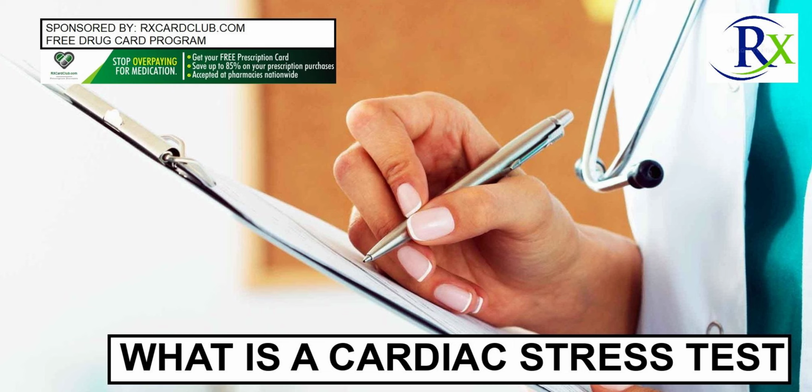The test is useful in diagnosing coronary artery disease, CAD, a condition often missed when a person is at rest. It can also be used to monitor the health of people with other forms of heart disease. This article explains the types and purpose of stress tests, and how they are done. It offers a step-by-step guide on what to expect, as well as information about interpreting stress test results.